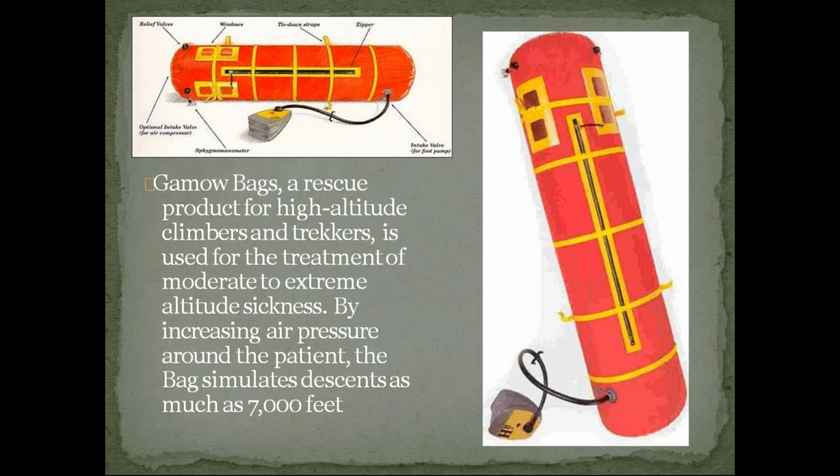Gamow bag, a rescue product for high altitude climbers and trekkers, is used for the treatment of moderate to extreme altitude sickness. By increasing air pressure around the patient, the bag simulates descents of as much as 7,000 feet.